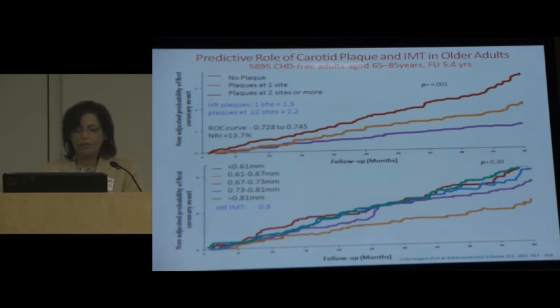So in this meta-analysis of multiple studies, which had at least 2 ultrasound tests performed, while the IMT at both the intervals predicted cardiovascular events with a hazard ratio of as high as 2, there was really no predictive value of changes in IMT in these 16 study meta-analysis over time. So progression is an area where we are weak.